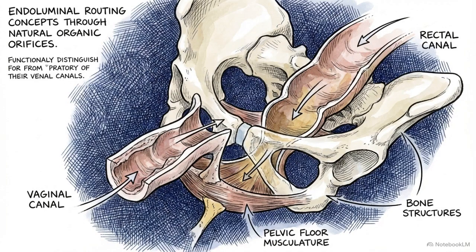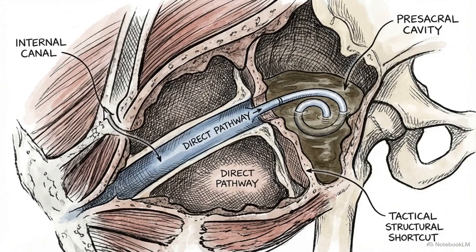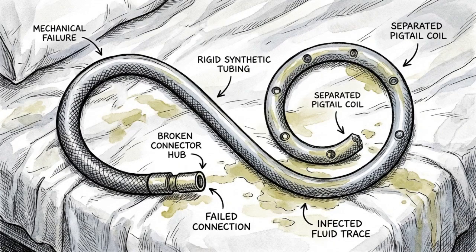Percutaneous skin access can be entirely bypassed by using endoluminal routes, specifically the transvaginal or transrectal approaches. Endoluminal access satisfies the 4 routing rules by providing a radiation-free shortcut through natural orifices directly into the dependent presacral spaces. These routes carry a fatal mechanical flaw. Natural body movement creates severe catheter instability, often expelling the tubes entirely within 3 to 4 days.